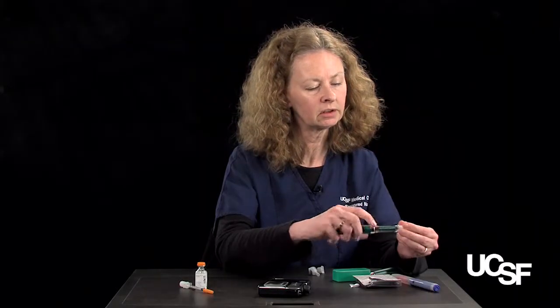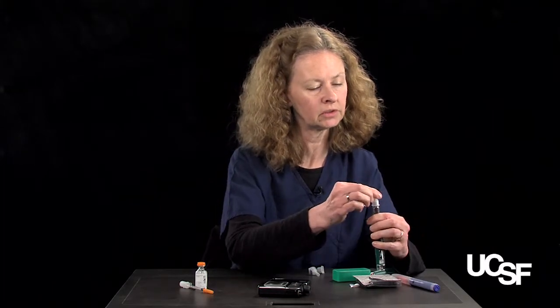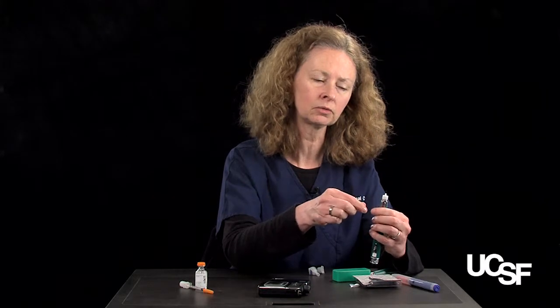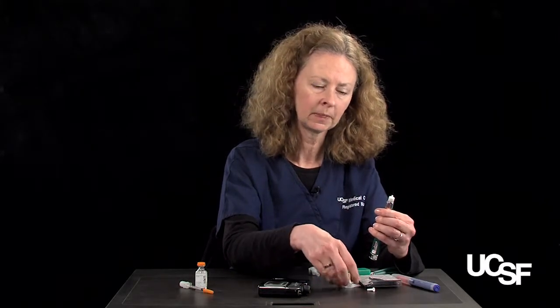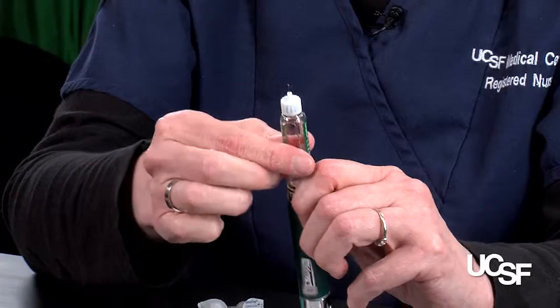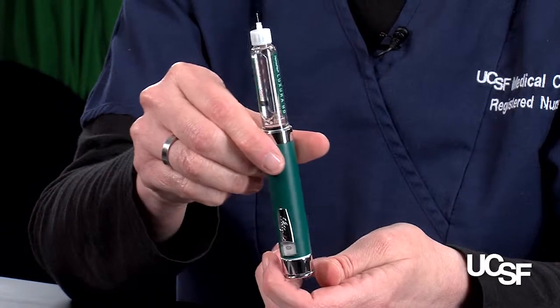What's nice about these durable pens is that they can dial in half-unit dosing. And for people who are on very small doses of insulin, that can be helpful. That could be someone who has been newly diagnosed with type 1 diabetes who is still making some insulin. Or it could be someone who has had diabetes for a very long time who really doesn't need much insulin. So you can see that that's the pen with the needle on it.